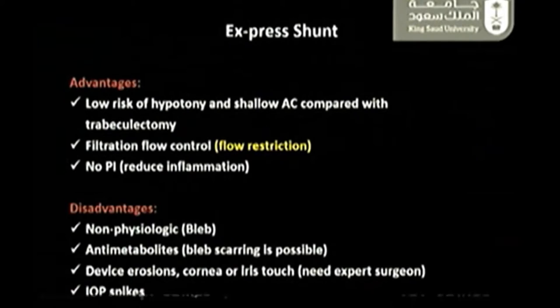Filtration flow is controlled. You have flow restriction because of the internal lumen size, especially the P50, and you have a good flap closure. You don't need to create a peripheral iridectomy, so you avoid the risk of inflammation after that. However, there are certain disadvantages.